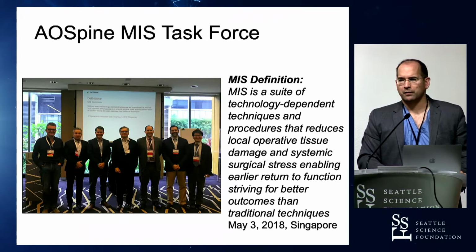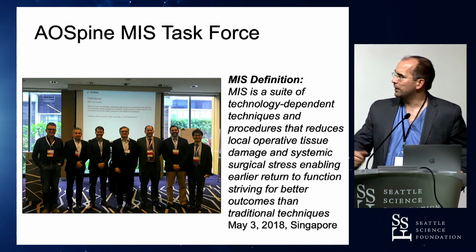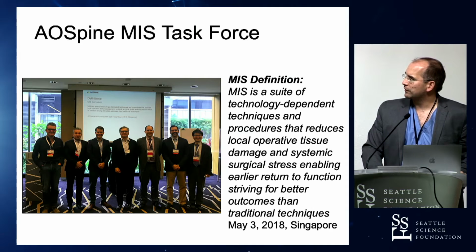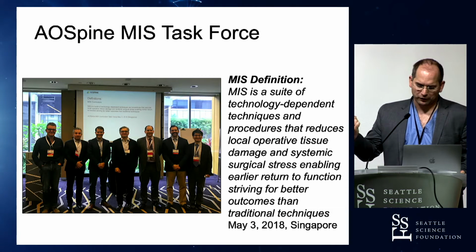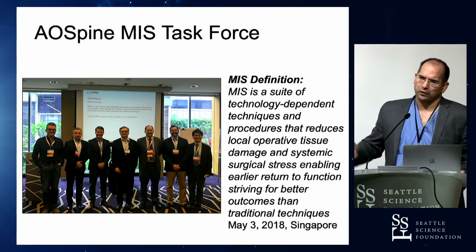Now, you don't need an endoscope or a tube or a microscope to be a minimally invasive surgeon. That's why I'm putting this up there. In the AO Spine, we have this MIS task force under the leadership of Roger Härtl. We already heard his name before. And we kind of try to think about it.